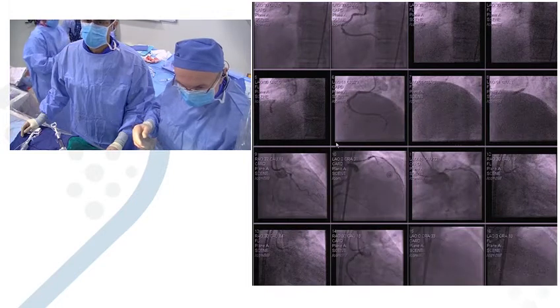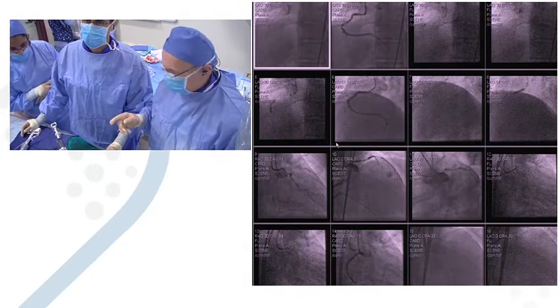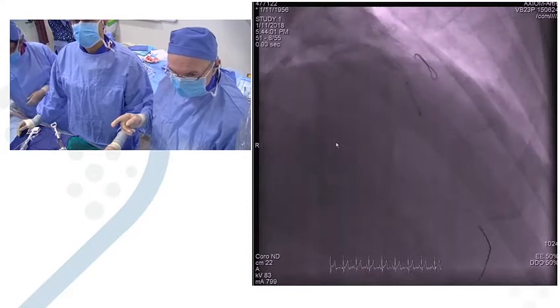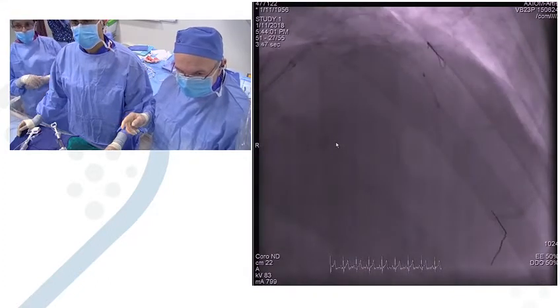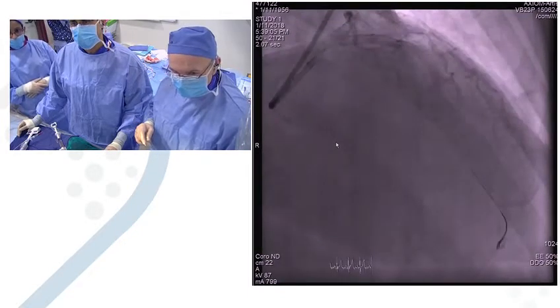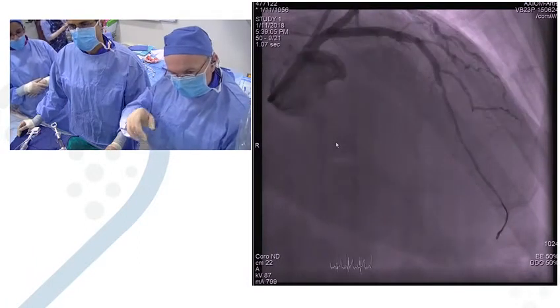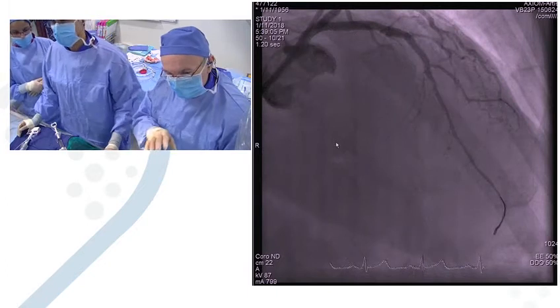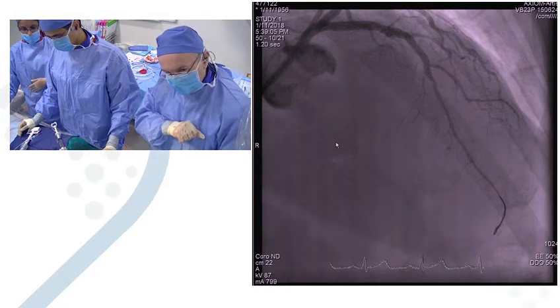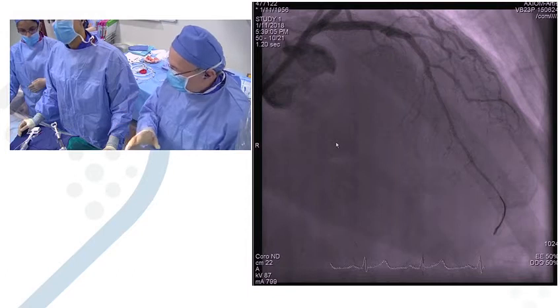So you left us when we were planning to do the stenting, I think. The circ stent, yes. Then we did, according to IVUS, the sizing of the stent. We put 2.5 by 28 right where the second diagonal takes off, and proximal 3.5 by 38 until the ostium.